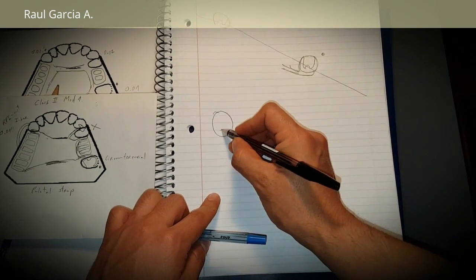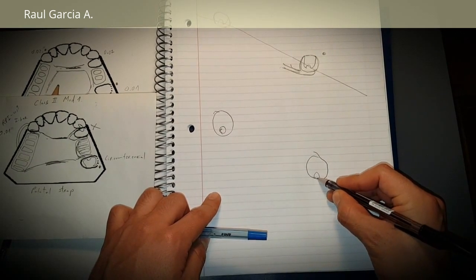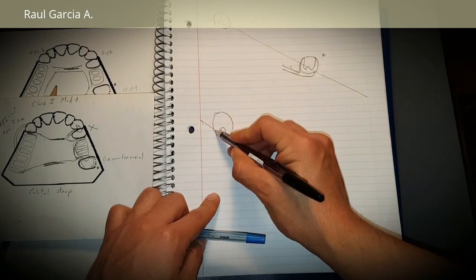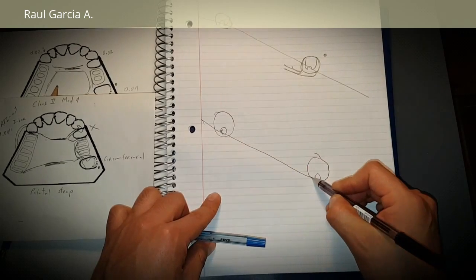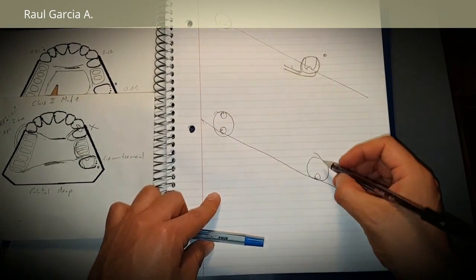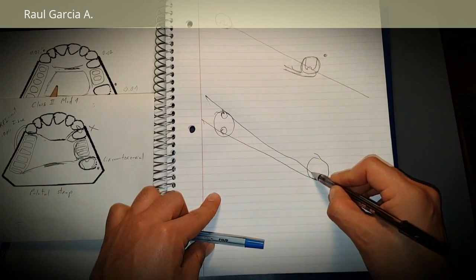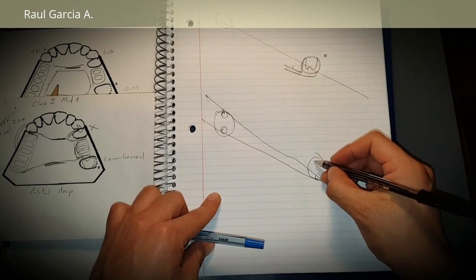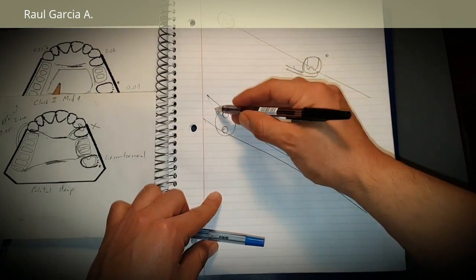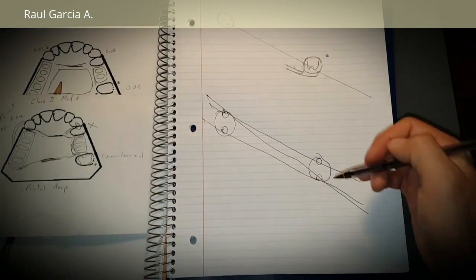from here and a rest here, that would be your fulcrum line. If you decide to put your rest here, that would be your fulcrum line in the same case. If you decide to put it here, then that would be your fulcrum line. So what is the fulcrum line?